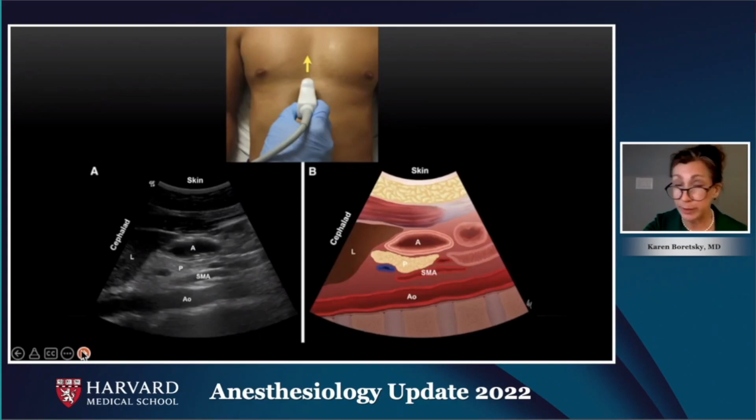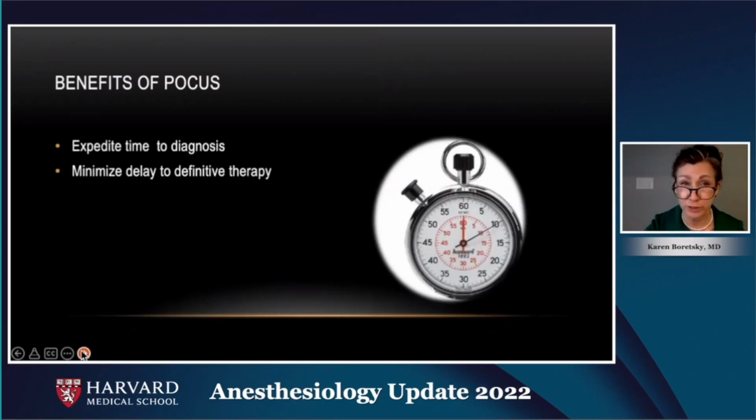The last of the three major POCUS applications I'm going to talk about is gastric ultrasound. We can use gastric ultrasound with a sagittally midline placed transducer over the gastric outlet. An assessment can be made about the volume of the gastric antrum to determine whether or not the patient has eaten recently or whether there's a risk of aspiration with a full stomach.